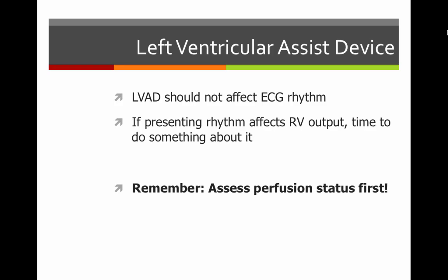So the only time we're going to treat the rhythm on the monitor, and again we're treating the patient, not the monitor, is if it's affecting right ventricular output, which is going to affect left atrial filling and left ventricular filling and the pump itself.